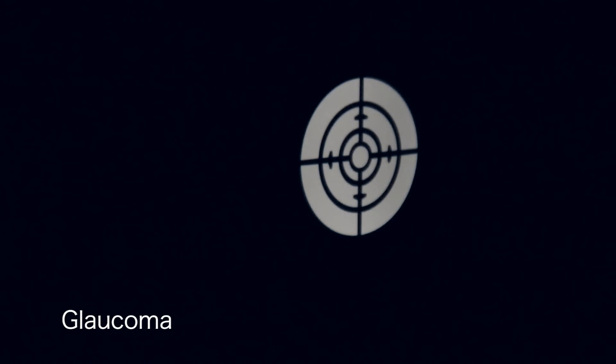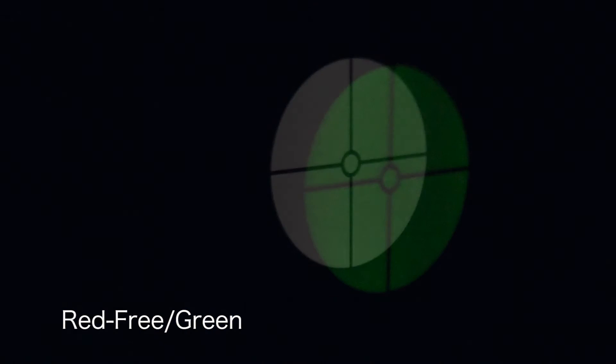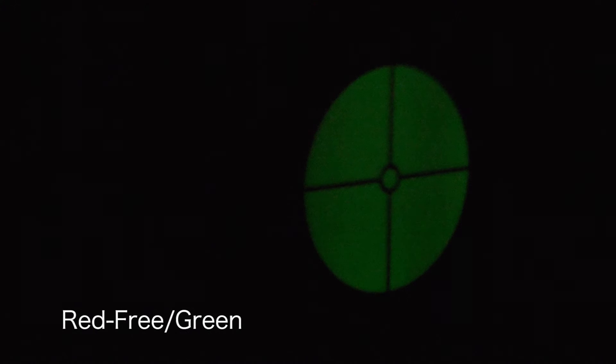The glaucoma beam projects a graticule onto the retina to assess optic disc to cup ratio and to aid in glaucoma diagnosis. The fixation cross projects a graticule onto the retina for assessment of the degree and direction of eccentric fixation. The red-free or green filter is used to examine blood vessels in fine detail. Cobalt blue is used with fluorescein dye to detect corneal scars and abrasions.